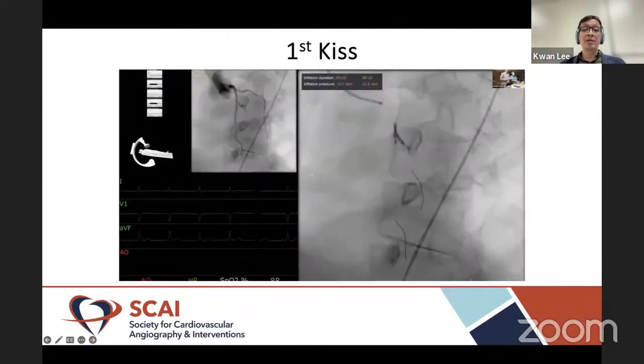I think it helps still. So this is a picture of the haptic feedback that you get back from the system; it hasn't quite caught up with that part of it just yet. Yeah, for bifurcation especially, it's just too complex to simulate, right? Absolutely. Like, how do you simulate wires wrapping around each other and the effect you would have on your balloon, but it's just very hard to do. The degree of computational power for that is going to probably be at least another generation now.